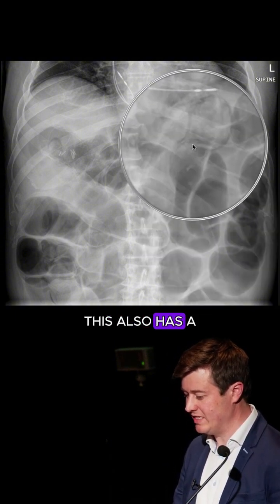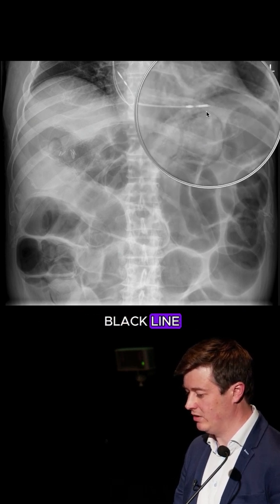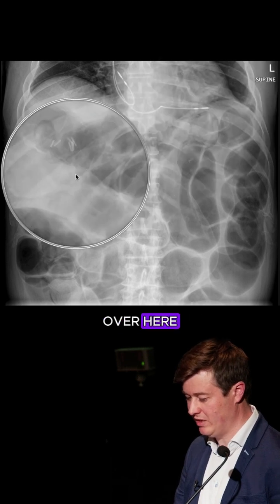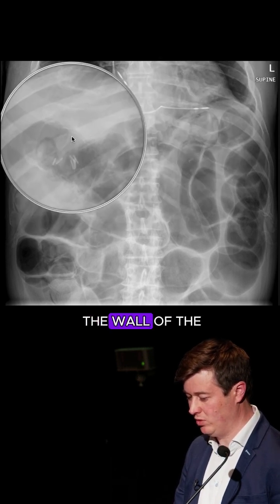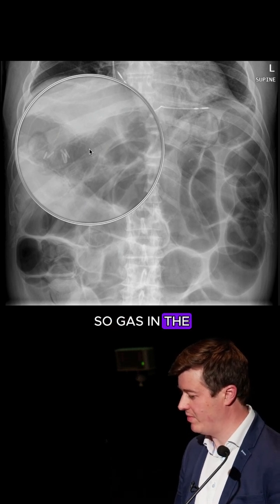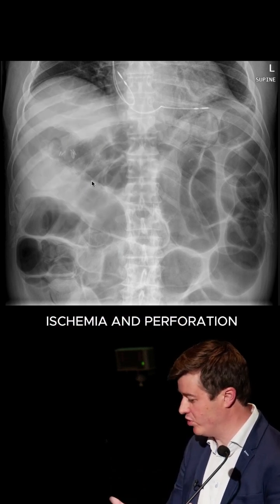This also has a nice example of intramural gas. See that kind of black line, curvilinear, outlining a bowel loop? Over here, maybe black lines in the wall of the bowel here. So that's intramural gas — gas in the bowel wall. So signs of likely ischemia and perforation.